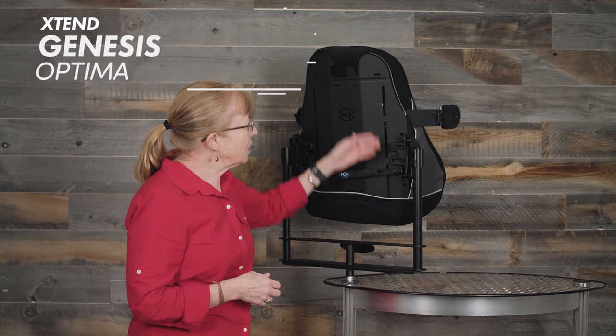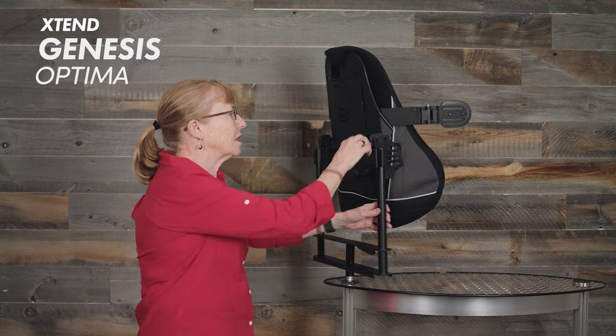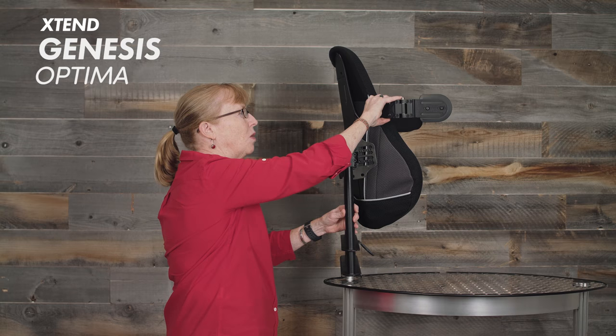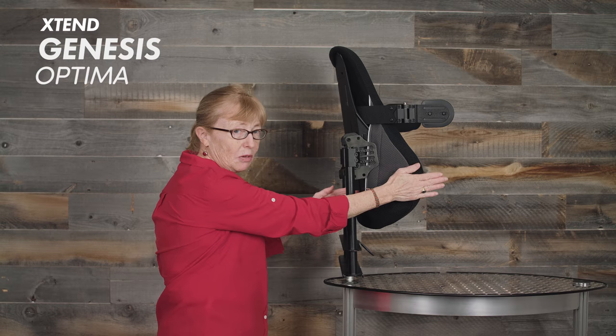On all the backs, we have the slots for the external lateral supports. These are not attached right now, but just to show you — I can have it go up or down depending on where I need the support. I could actually have it all the way down here and coming out here.